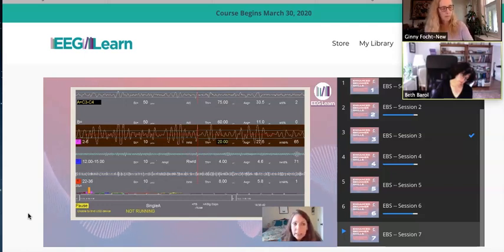When you're using one of those interhemispheric protocols, I'm going to tell you what those average amplitudes should be to have a reasonable amount of shared activity, or a reasonable amount of difference between those two sites.